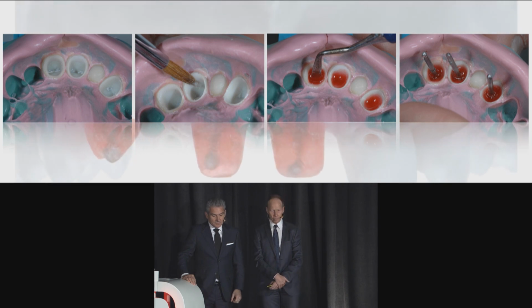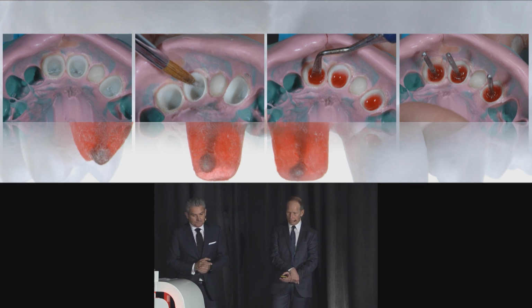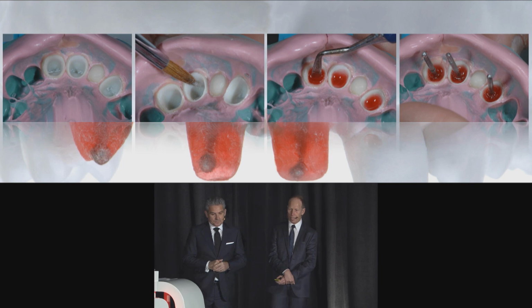So this is Lola, and I'll go briefly through what we have been doing in Iñaki's practice. He did a pickup impression. We quickly made a model, of course, with resin in the dies or in the crowns, otherwise it will break, again with retention.